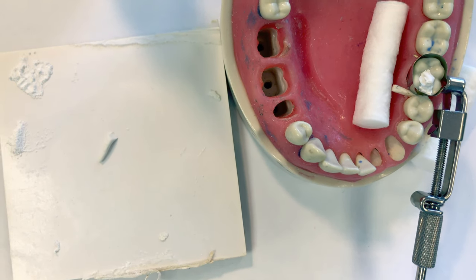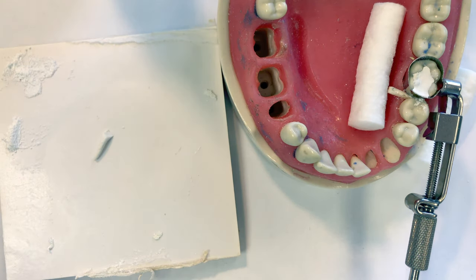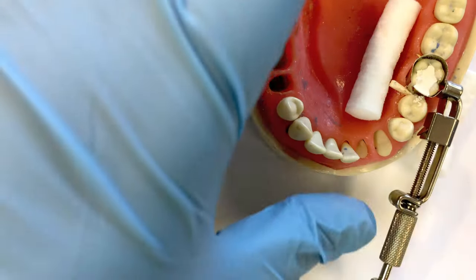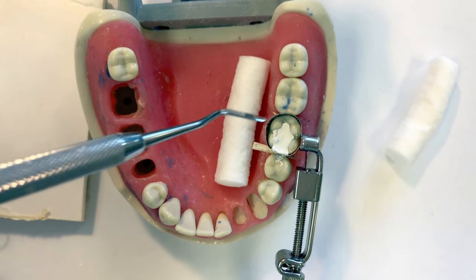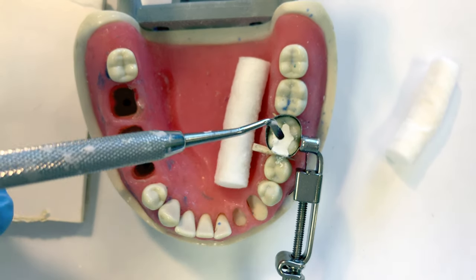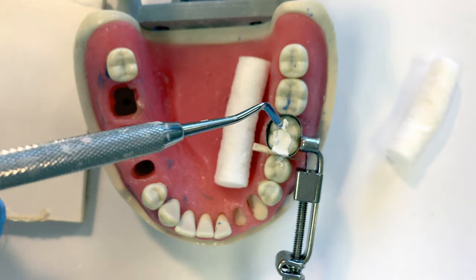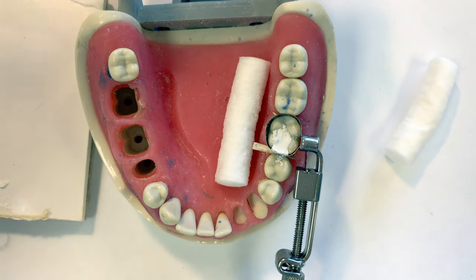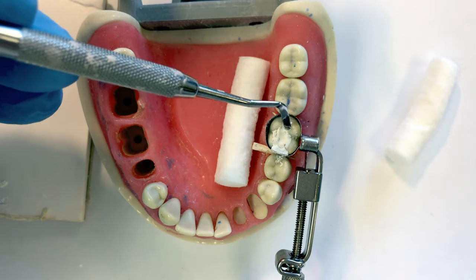Another way to easily compress this into the preparation is to dip your finger in the powder and press the restoration into place. I'll center this a little closer. Before it sets, let's get some anatomy back into this restoration. One mistake I see new assistants make is they just overfill — they leave it too high and really bulky. What we have to do is get the anatomy back into the tooth.